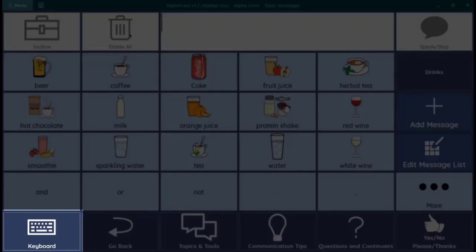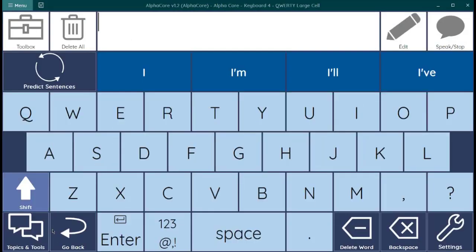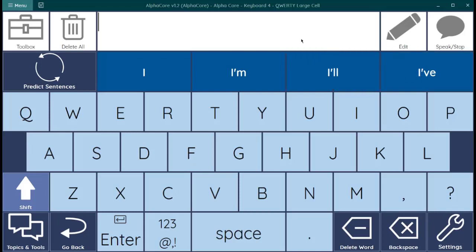Finally, at the bottom of the page is your keyboard so you can compose any message you'd like. Now, most keyboards in AlphaCore provide you with word and sentence prediction. Here you can see word prediction. Some keyboards provide a separate row for each, but on other keyboards, like the one you're looking at, you need to select which you want to be looking at using a toggle.